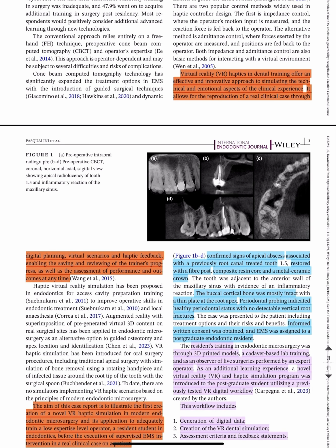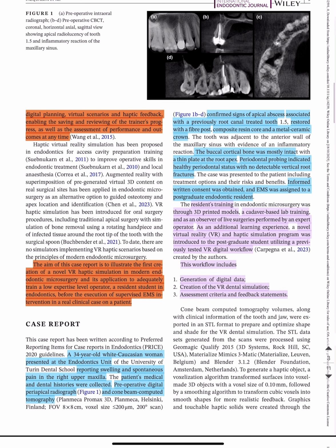Virtual reality haptics in dental training offer an effective and innovative approach to simulate the technical and emotional aspects of the clinical experience. It allows for the reproduction of a real clinical case through digital planning, the virtual scenario, and haptic feedback, enabling the saving and reviewing of the trainee's progress as well as the assessment of the performance and the outcome at any time.